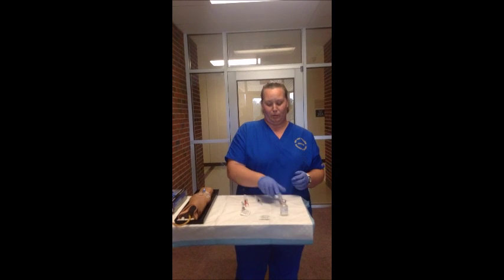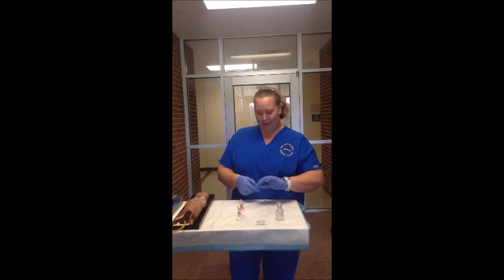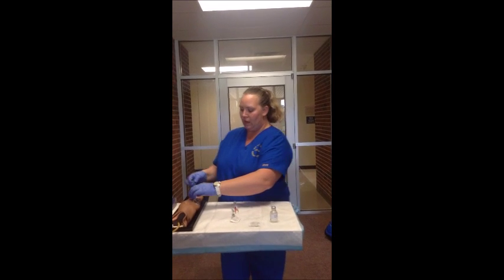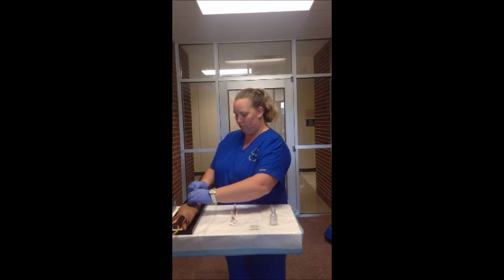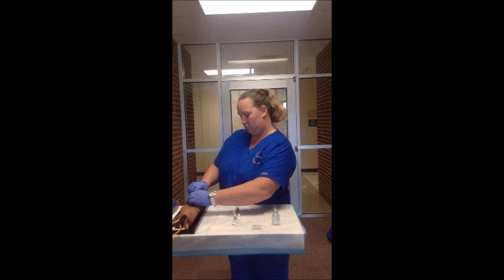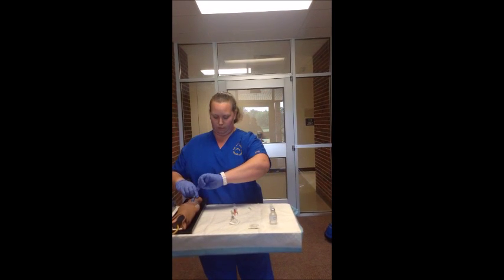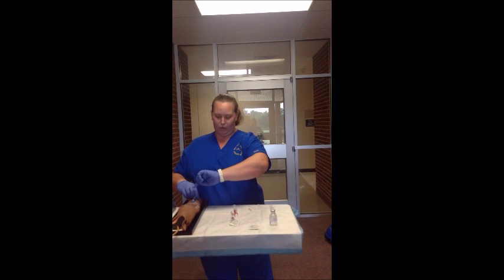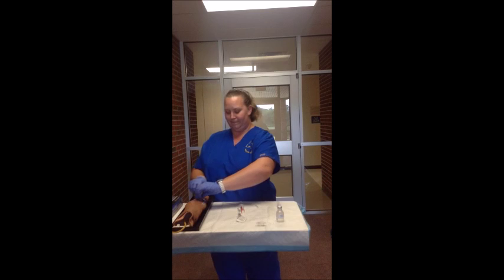We're saving all these for practice purposes. And then at that time I will go ahead and administer the morphine at 15 seconds for a 1 to 2 minute period.